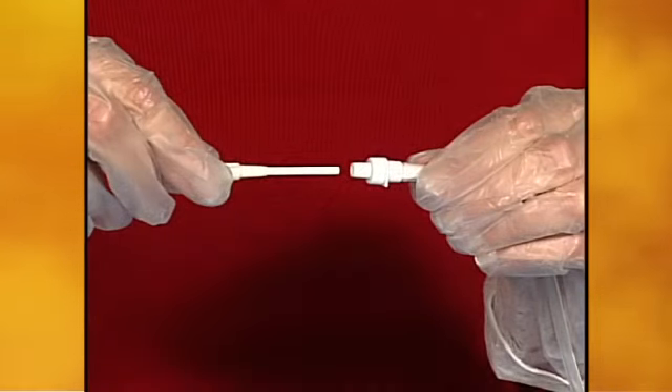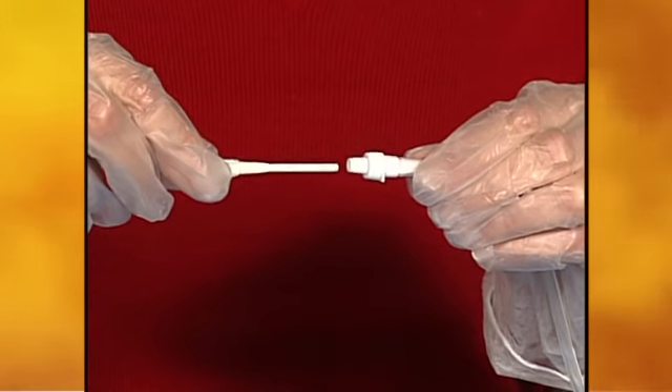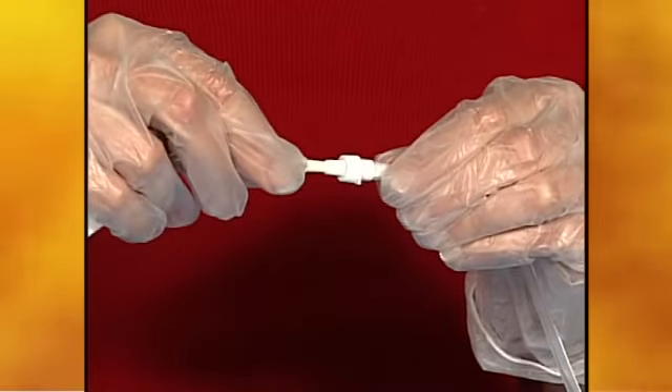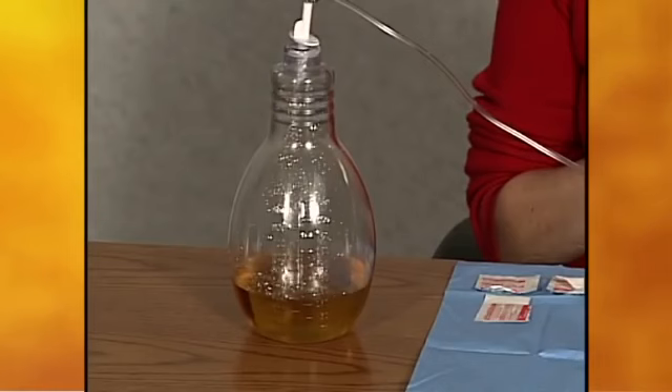Remind your patient to keep the access tip on the drainage line and the end of the catheter clean. Simply attach the vacuum bottle to the Plurex catheter using the drainage line. The vacuum bottle provides suction to drain the fluid.